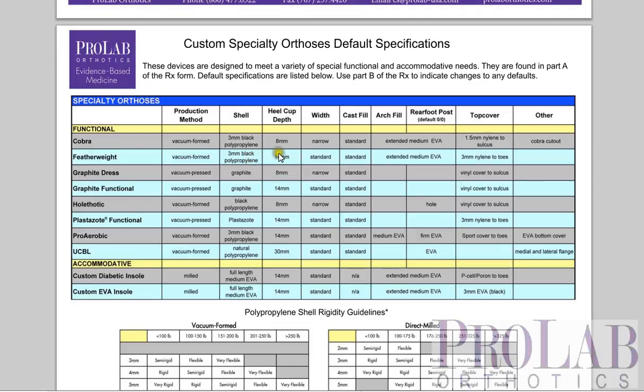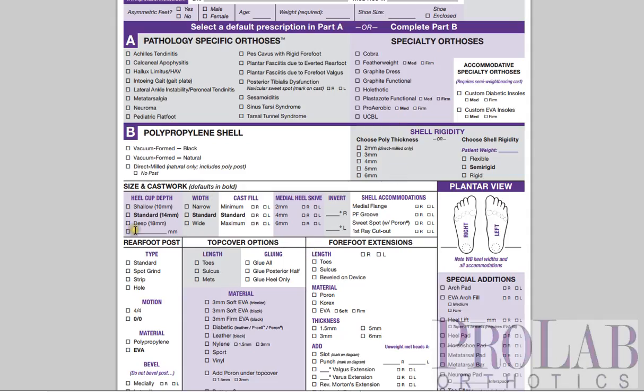And if you want, you can override those defaults down in part B of the form. So for example, if you wanted to change the top cover from an EVA — which might be its default — to a nyline, which is a Spenco-like material, you could just do that down here. So that's the specialty orthoses on our form. I'd advise also looking at the other videos on the overview of the form and the other sections.